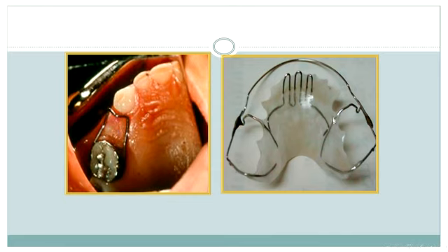In the other type, a habit breaker is used for stopping the habit; here the cribs or any type of configuration can be embedded in the translucent or white acrylic, and therefore this can prevent thumb sucking by the child, or prevent the tongue from touching the palatal side of the teeth.